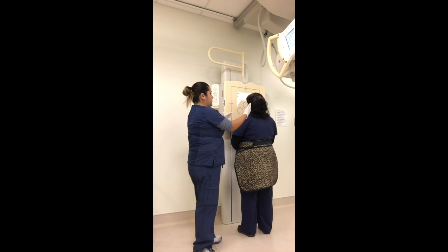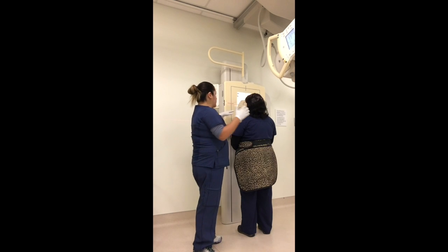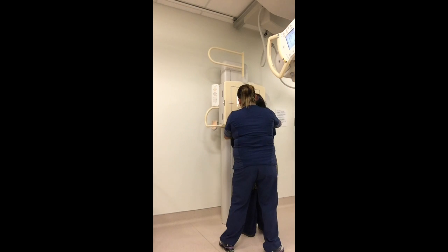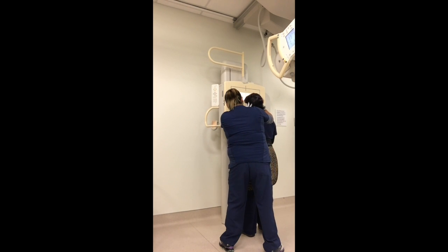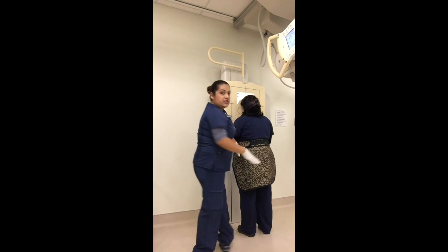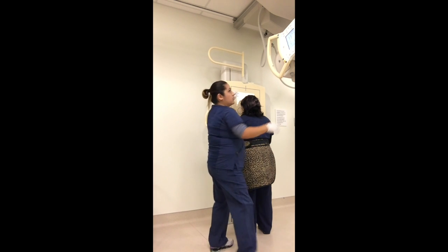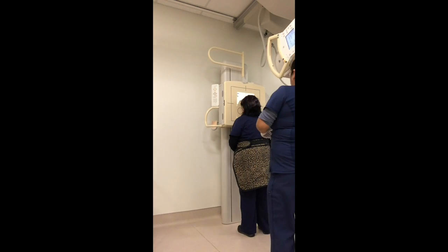And I'm going to position my patient so that her mid-sagittal plane and her OML are perpendicular to the Bucky. And my patient is shielded.